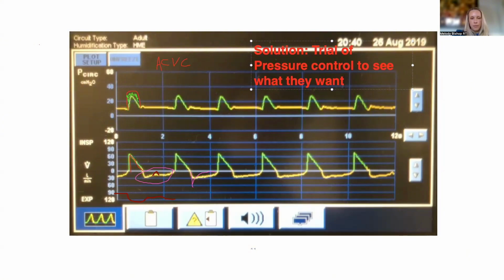Which essentially are the same. So for me, if I switch the patient to pressure control, and I do this all the time, honestly, because usually if you made me guess, I would say this is a patient with probably emphysema who gets put on volume control and gets tied to a volume that is like 6 cc's or thereabouts, like 450 or something like that. And then they get super tachypneic.